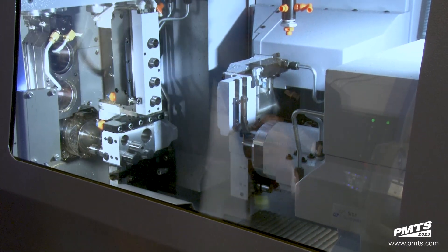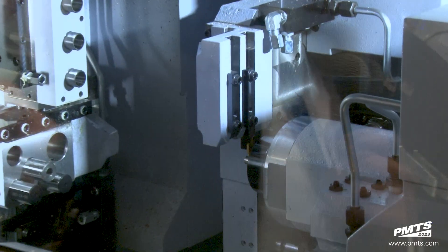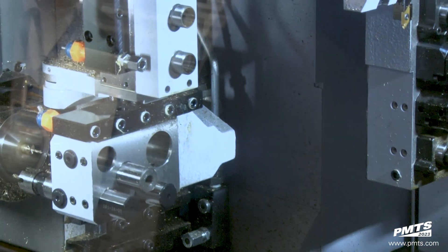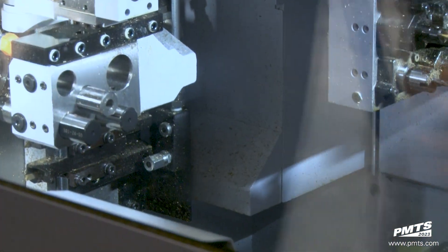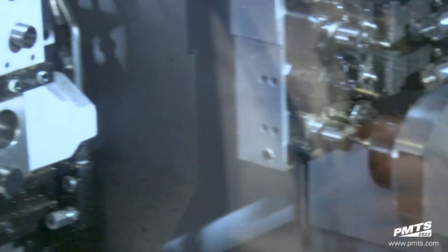What it's doing right now is starting the back working — the actual OD turning with the two turning stations — while the front is drilling the screw cannulation, the deep hole drilling. It's peck drilling right now.